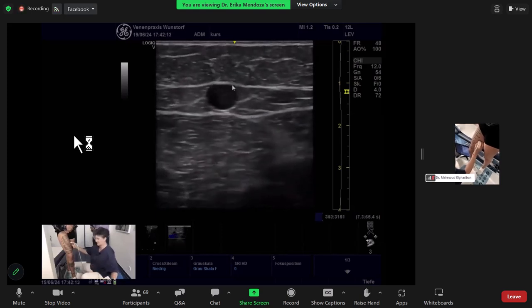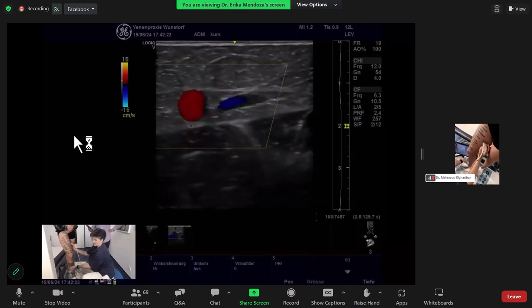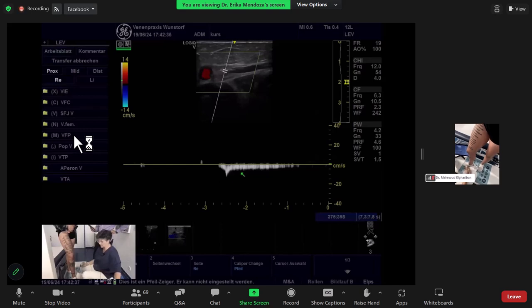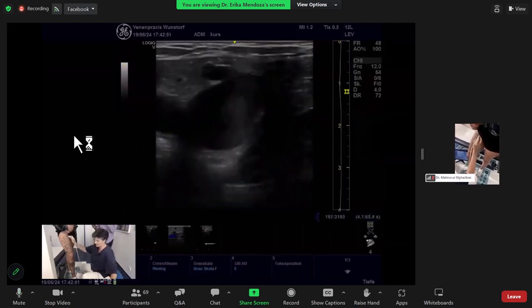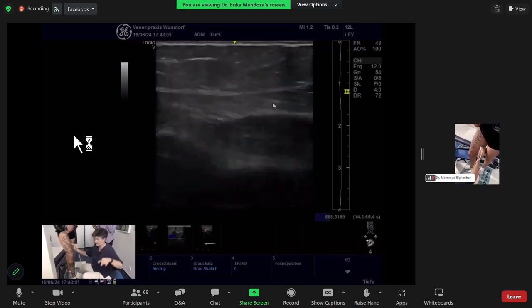You look, this one is the saphenous vein interfascially. Here is another vein coming. Just stop and have a look. There is a vein joining in. And this one is also having a reflux, as I suspect now. And this one is an obvious reflux longer than 1 second. So you have two refluxing tributaries going to the great saphenous vein, which after the mid-thigh looked like a normal vein. So we have one reflux coming from the epigastric and one going a little bit down from the accessory posterior vein, which usually comes from the pudendal labial veins.